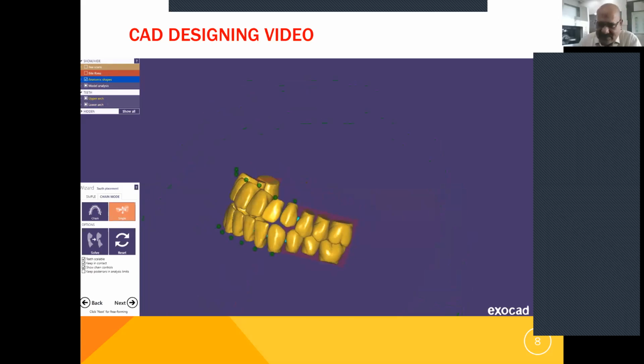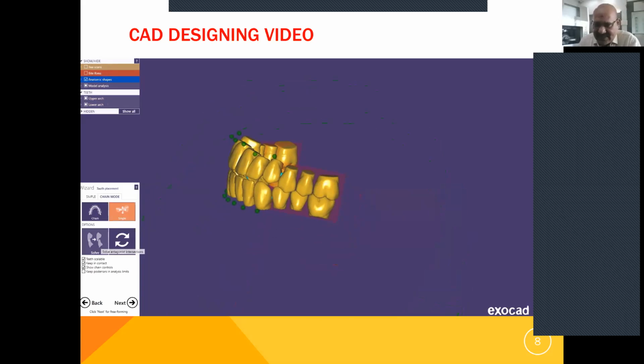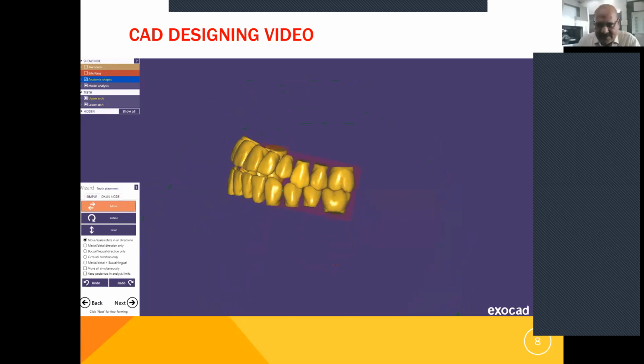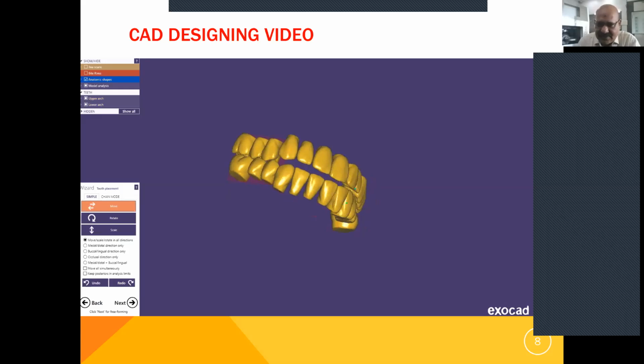Dr. Mehrotra, if you suggest, after this I could do a live designing also, or we could jump to implant designing, custom abutments, and one example of a bar. So this could be interactive. If anybody wants to ask anything, I would be able to understand and reply.